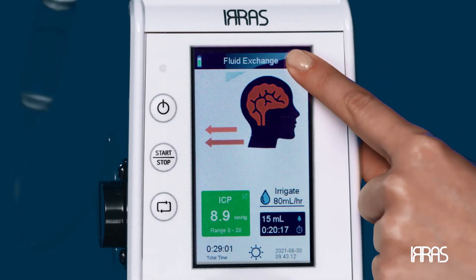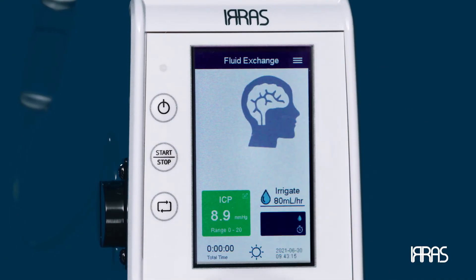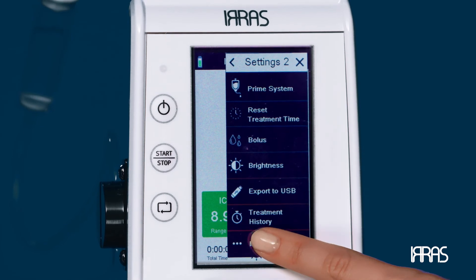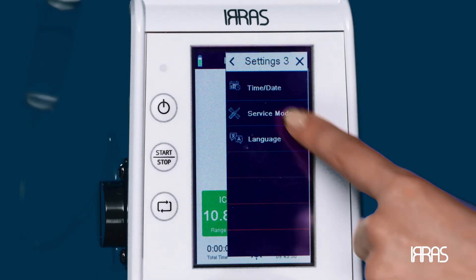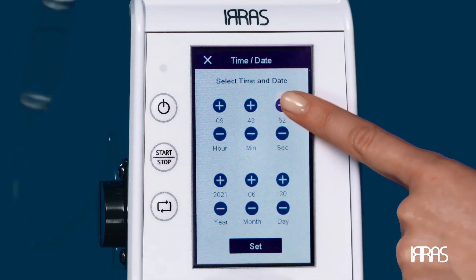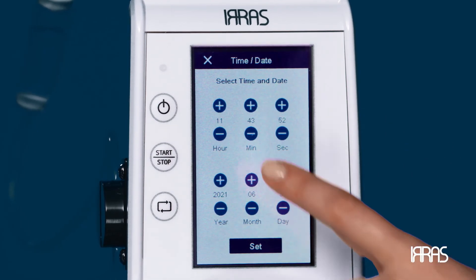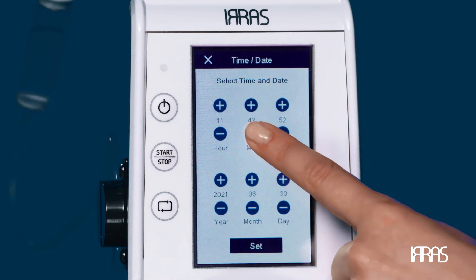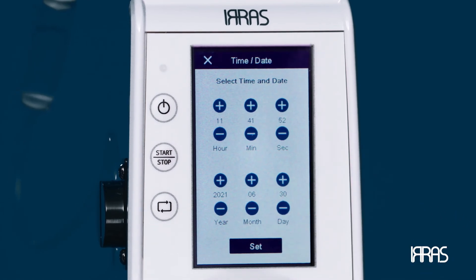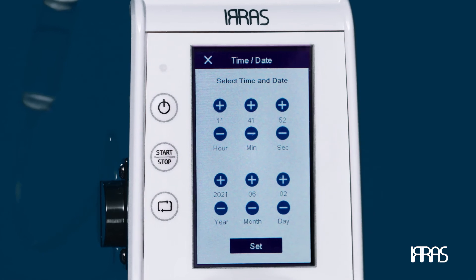Date and time — to modify the current date and time of the control unit, press the settings menu and select the date and time option. Using the touchscreen, you can adjust the settings to the correct and current date and time. Once set, return to the main screen.